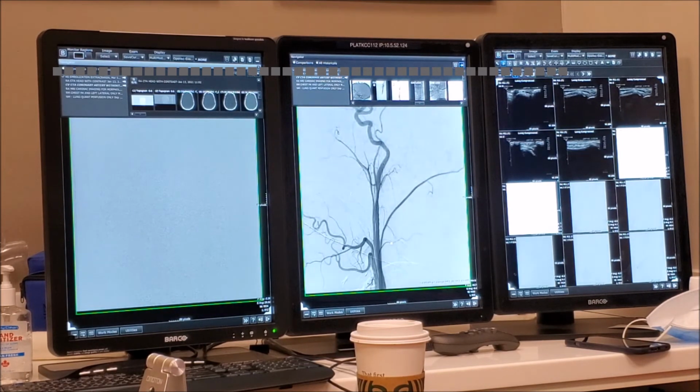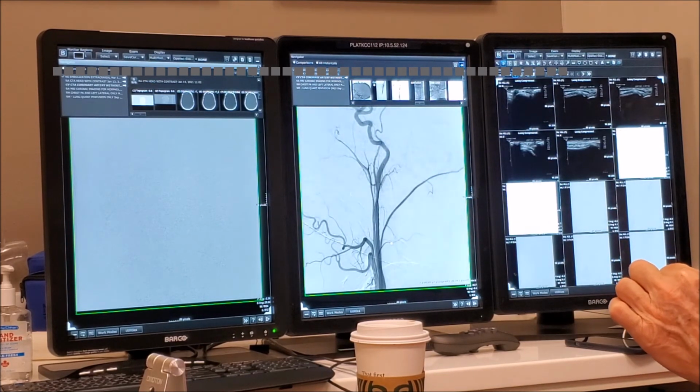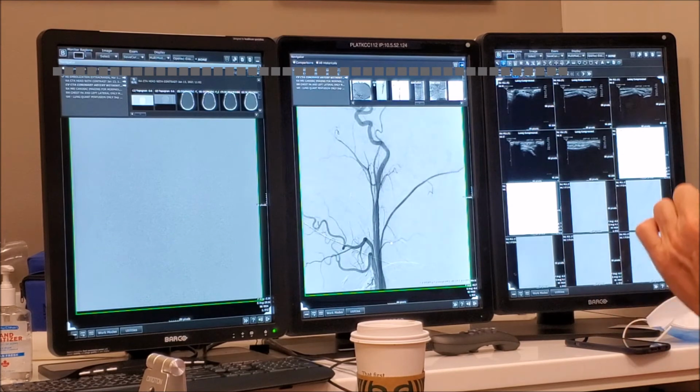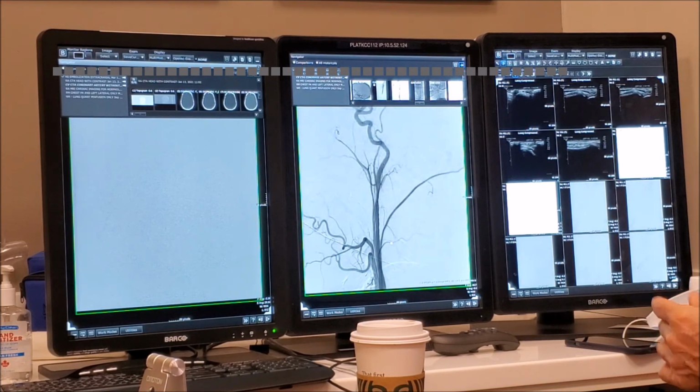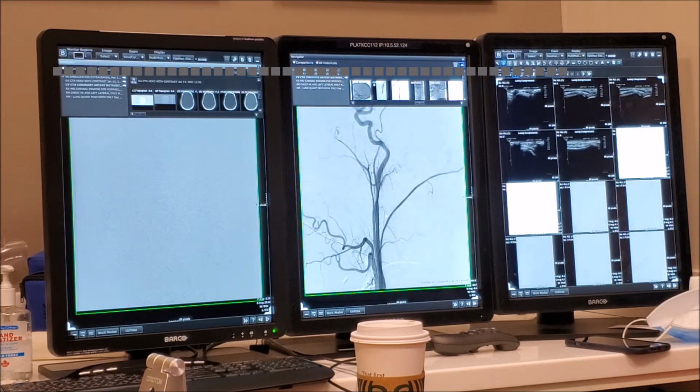If you're doing epistaxis, to make it safe, you use particles that are about, let's say, 150 to 300 microns, and you just let the flow take them. You don't push them, because these are living structures. Although the vessel may be this small, if you push it too hard, you may. The limiting factor is the bone, but in the soft tissues, the vessels will have elasticity.